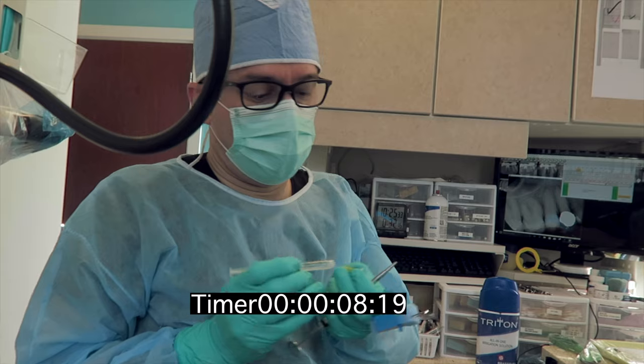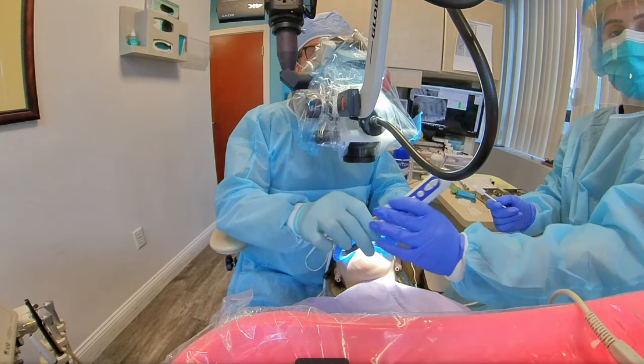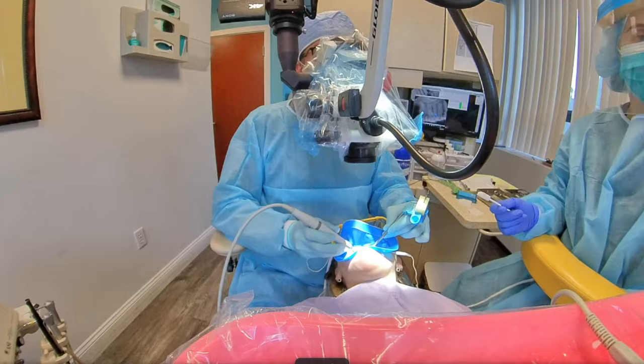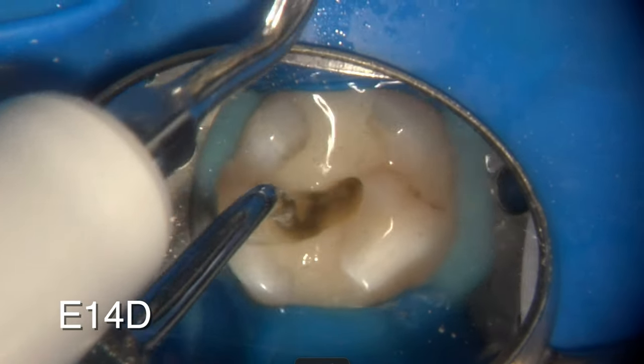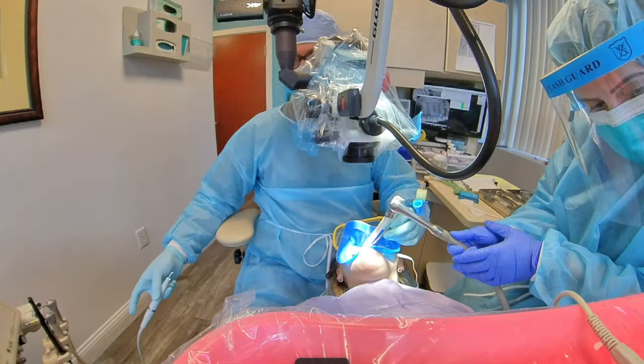What I prefer to do is use agitation with ultrasonics and water to help remove some of the debris that has been packed during the rotation or reciprocation motion of files into the canal walls. This debris is an impediment to file advancement, and the only reliable way to remove it is by using constant or intermittent ultrasonic irrigation with just water during instrumentation.